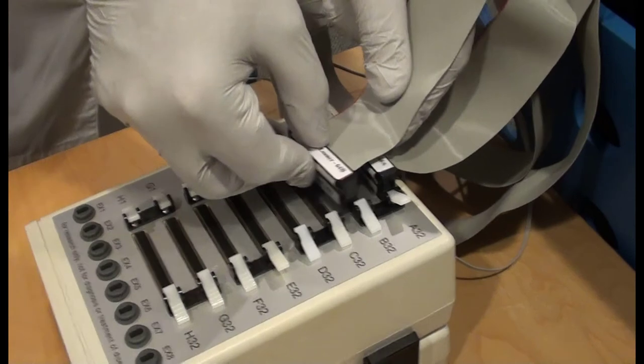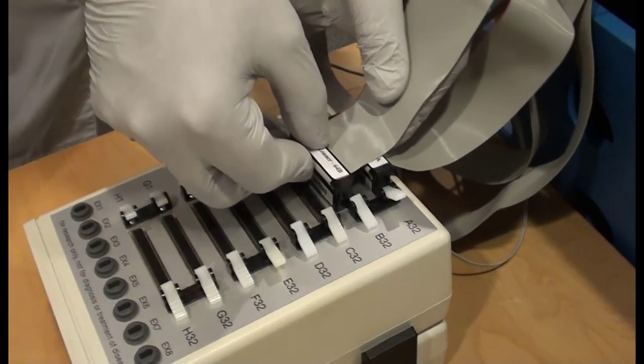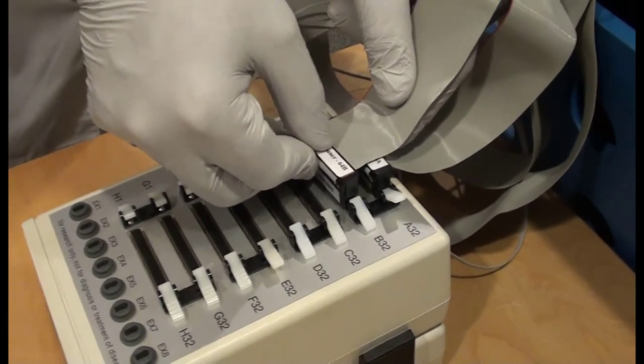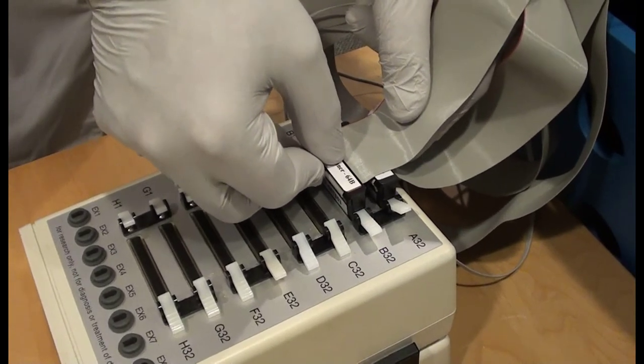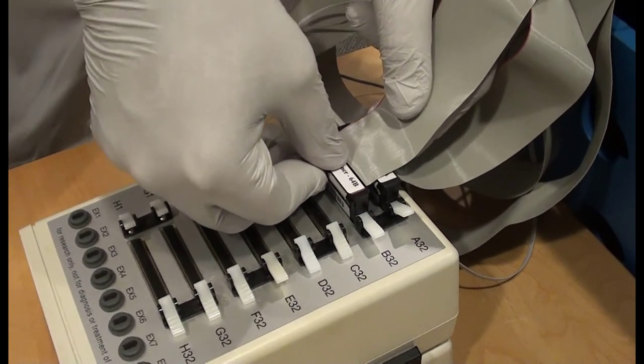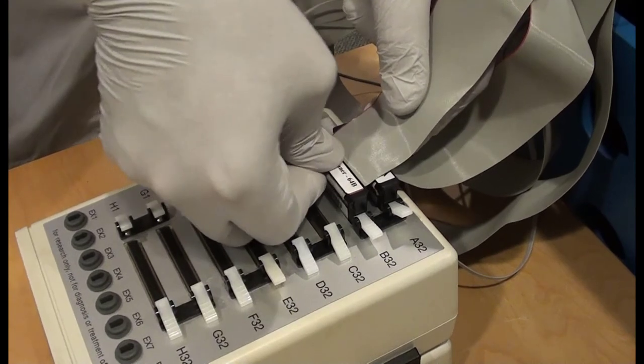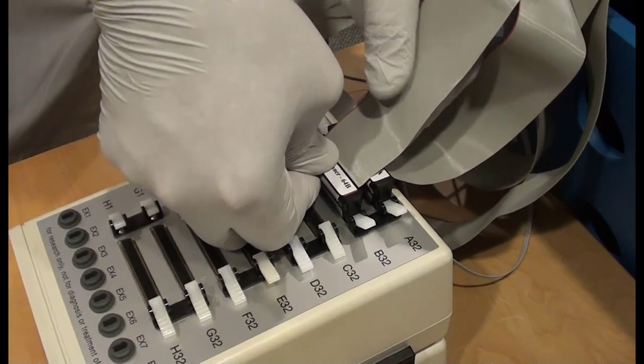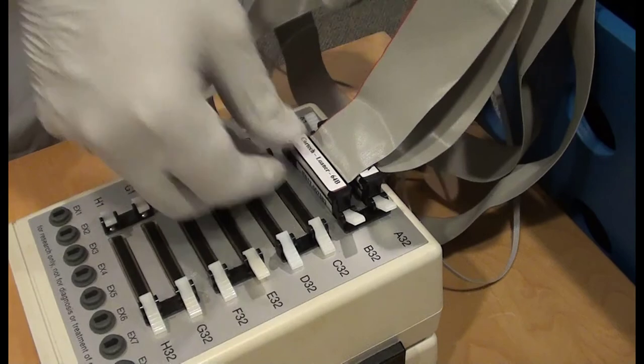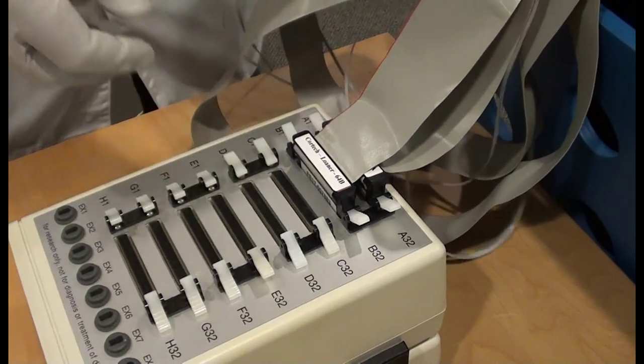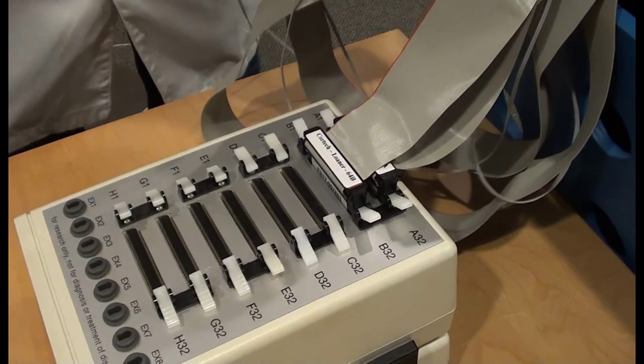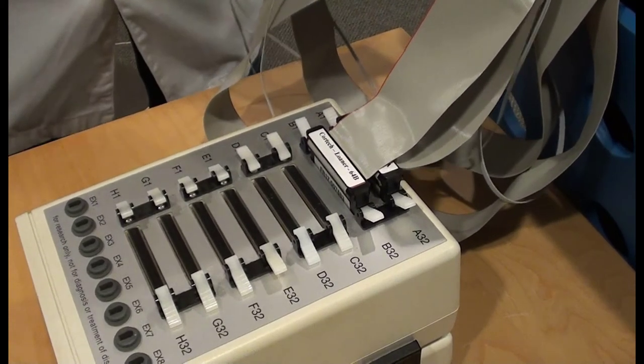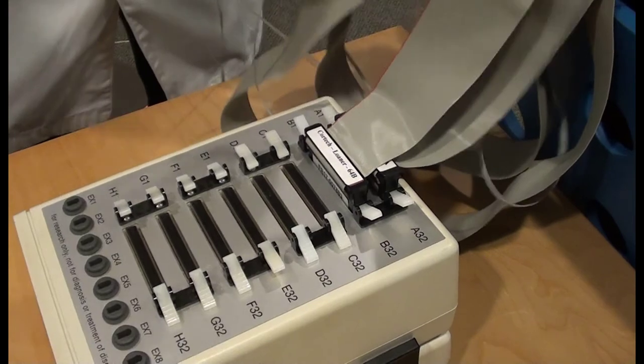Plug the electrode cables into the AD box. In this 64 channel example, the ribbon cable connector with the label ending in A goes in the A connector, and the one with the label ending in B goes in the B connector. Orientation is important. Make sure the red line on the ribbon cable is toward the left side of the AD box when you are looking at the front panel of the AD box. If you try to insert these connectors in the wrong orientation, it is possible to bend the pin on the electrode connector and or damage the connector on the AD box.